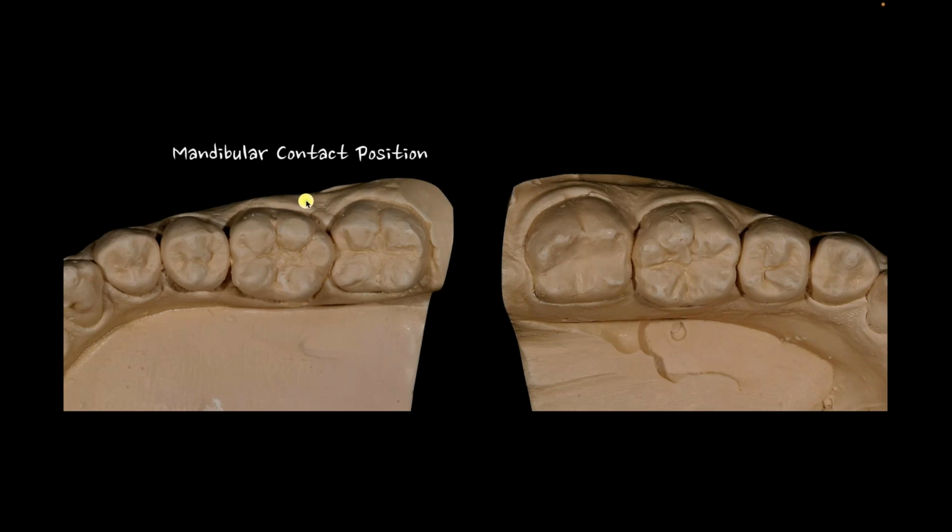So when you make a first molar on a lower, it should have almost a C shape into the second molar, and my contact points are much more in the very center of the tooth. So there are kind of equal embrasures between the facial anatomy and the lingual anatomy where food can flow through, and every angle of this is made for mastication.